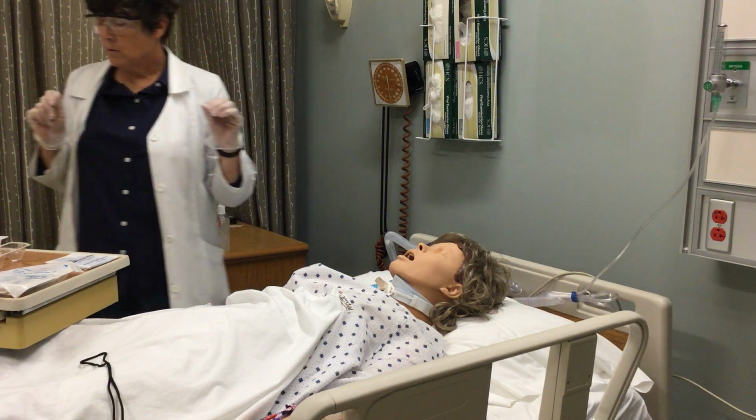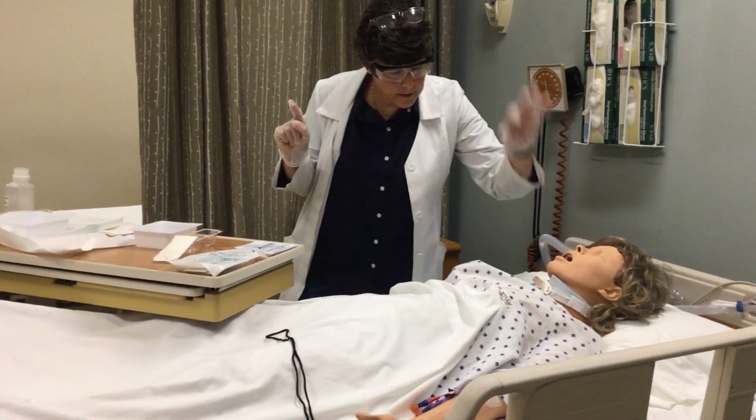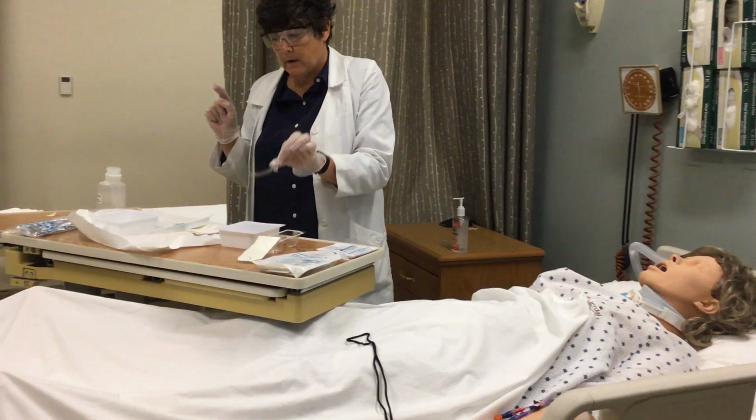So what I'm going to do for this, this is my normal saline I prepared earlier. I'm going to use my non-dominant hand, I'm going to pinch, and I'm going to drop that into that saline.